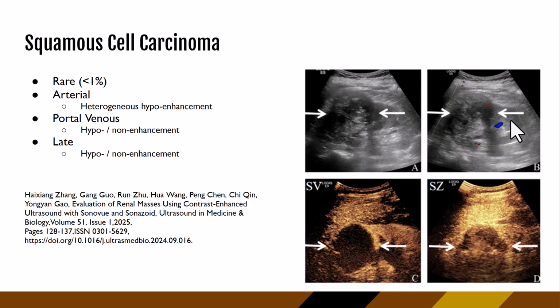So then in B here, we put color flow Doppler on. This is actually showing a lack of intramural vascularity, which can actually be kind of misleading. A lot of times when we think of cancers, we think of increased blood flow in the lesion area. So now that we don't have that increased blood flow, we might be thinking, well, maybe it's not as scary as it looked in grayscale. This might just really be a matter of slow flow within the lesion or disorganized flow that we're just not detecting with Doppler. So it makes sense then.